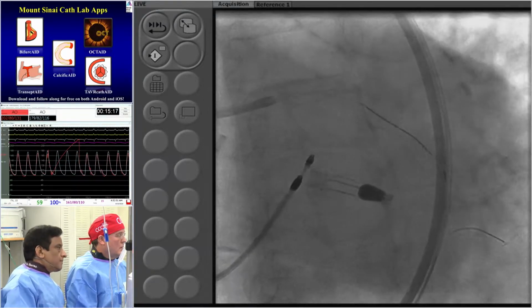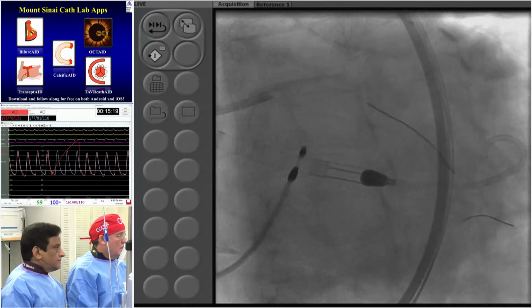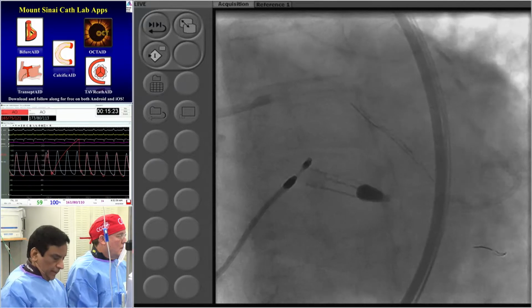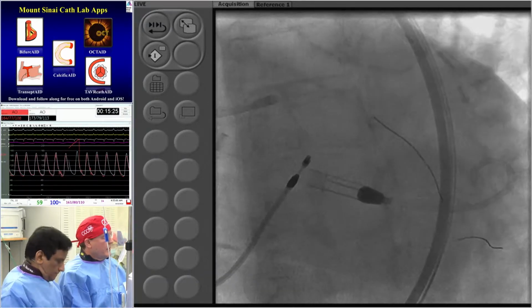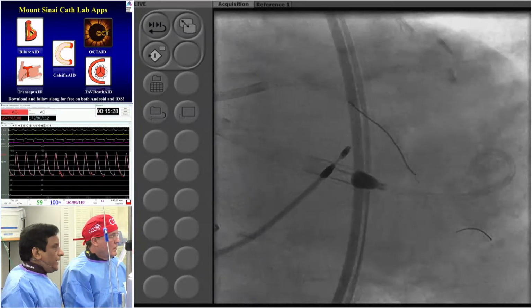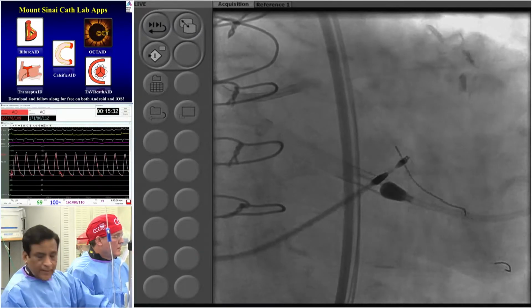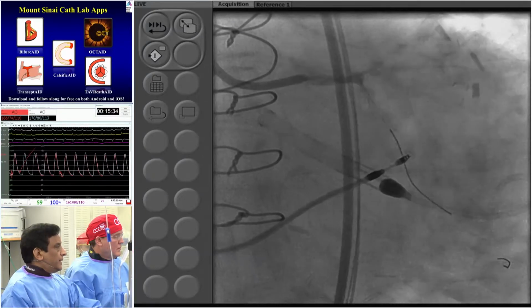So I think for this left main, Dr. Sharma, would you consider any scoring balloon as opposed to rotoblator? Absolutely, for sure. Yes. So this one will be, there's a tough wire in here. If it's a tough wire, you can leave this wire in the OM and we'll put a wire into the LPL, the over-the-wire system, and change it to the LPL, right?